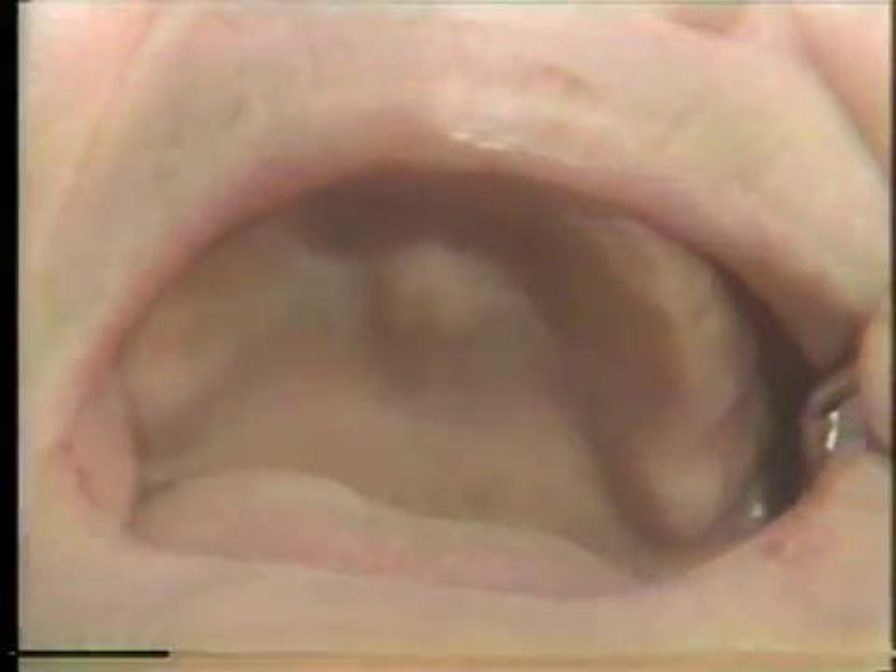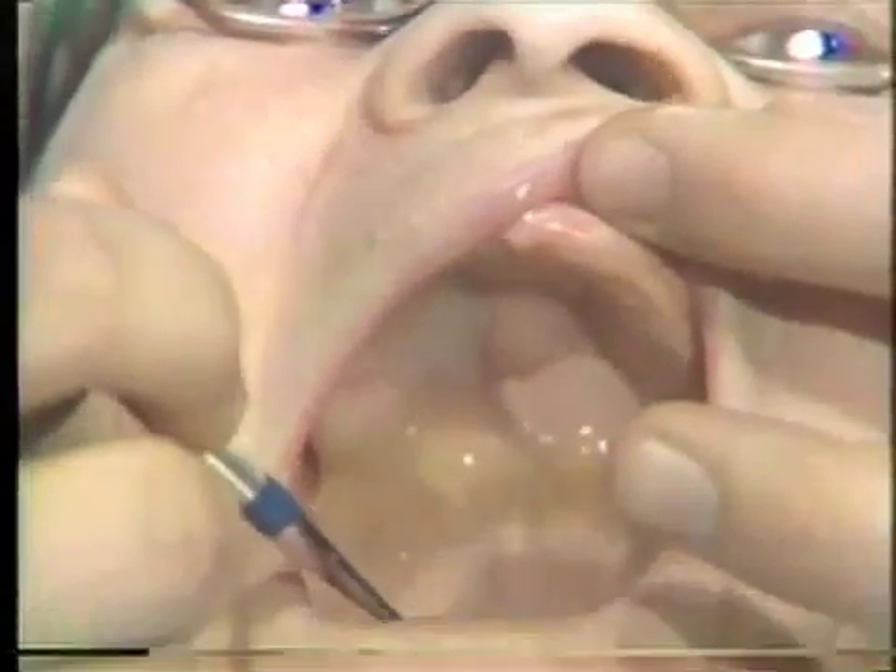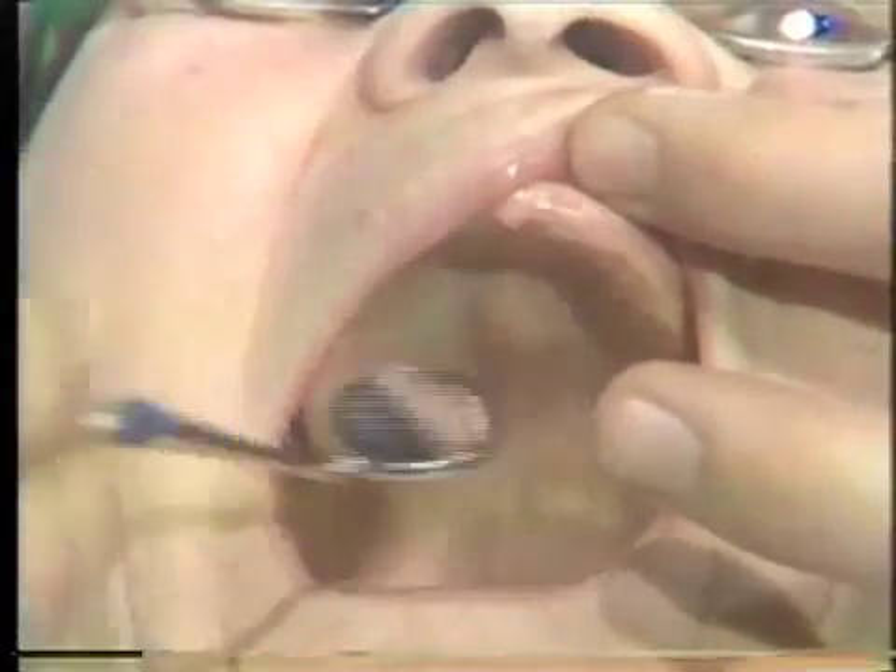Also visible are the tuberosity and the hamular notch. The posterior region shows the maxillary residual ridge and its junction with the soft palate.